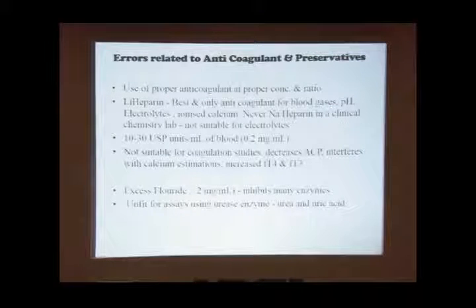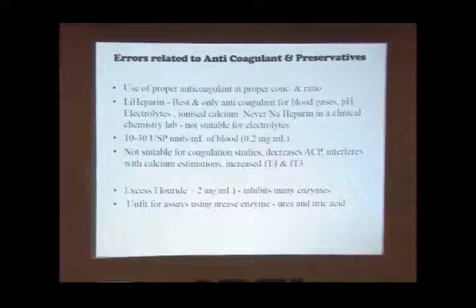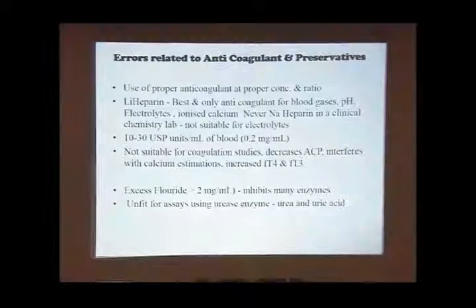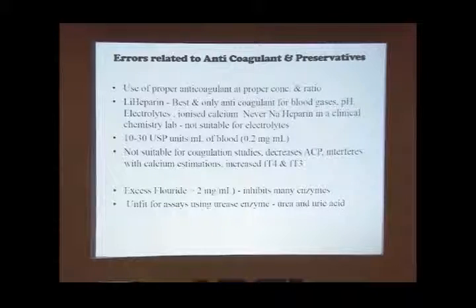And nowadays, a major percentage of the laboratories use pre-evacuated tubes, any brand, a good quality tube, but again, you have to be careful that there is also an expiry date for all these tubes. If the expiry date passes, many people argue what can go wrong, but the vacuum can go down, and that can result in drawing lesser sample, which means the ratio between the anticoagulant and the sample can come down. So you have to be careful in using the right tube.